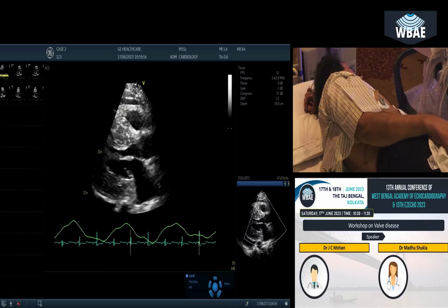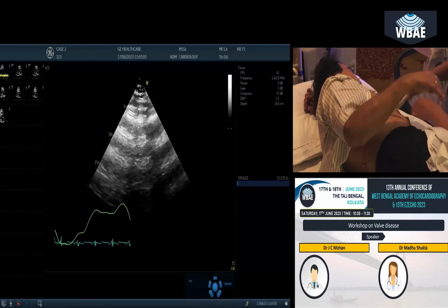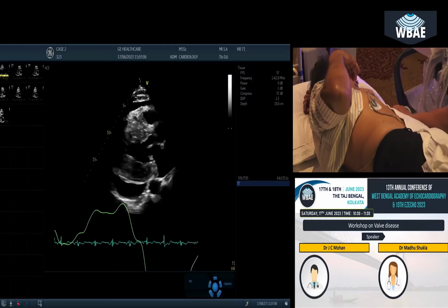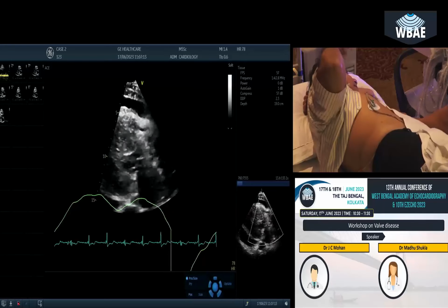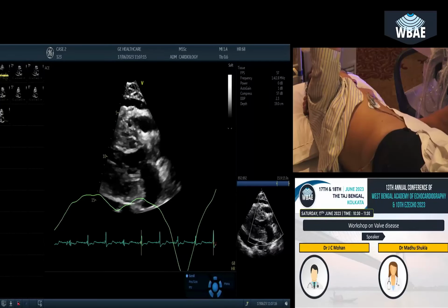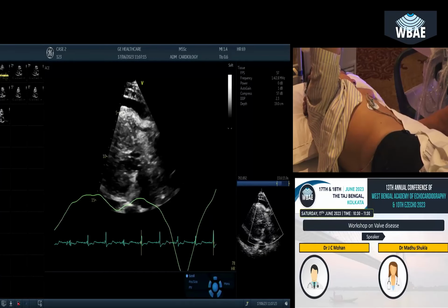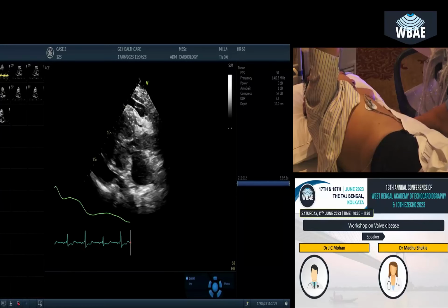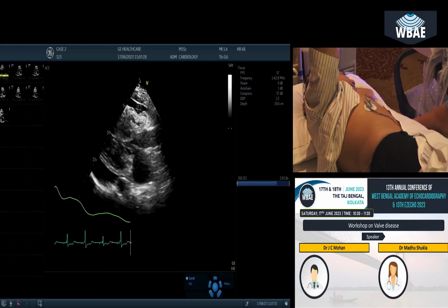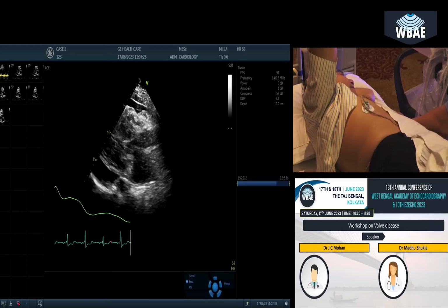I'll show. From here we should measure the left atrium quickly, because that gives us an idea about the filling pressure. Let us measure the left atrium, inner edge to inner edge, in end systole, at the level of the aortic valve. We are going to spend some time on the papillary muscle, definitely, because anterior displacement of the papillary muscle is typical in hypertrophic cardiomyopathy. Myocardial crypts are another thing we will be looking for. Not that they are very specific, but each of them adds a point.